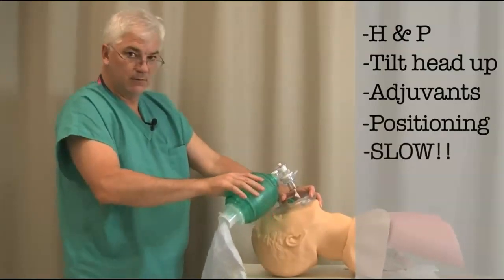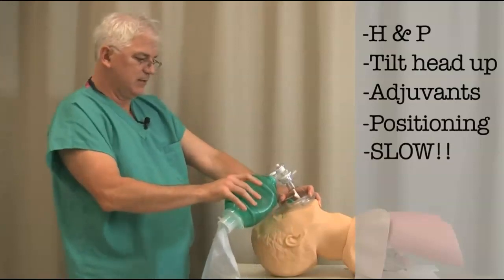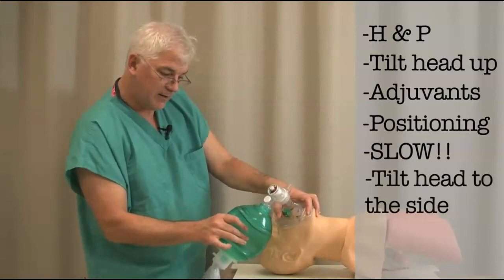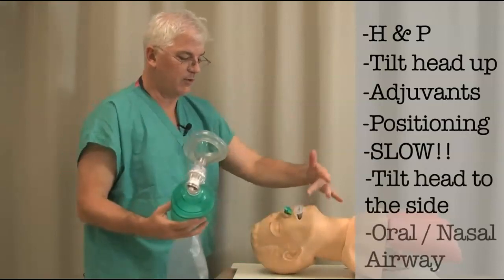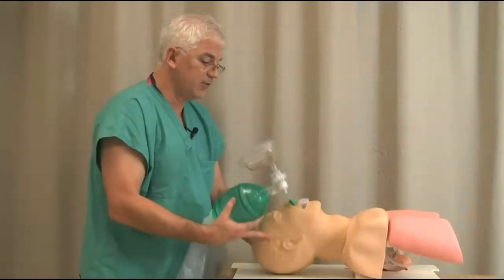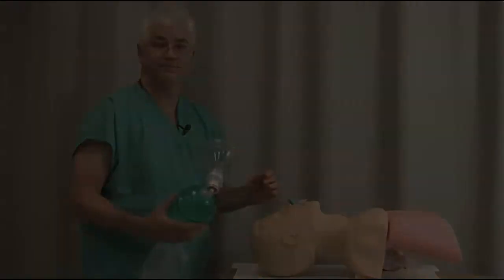Squeeze slowly. Don't do that. Squeeze slowly. Tilt their head to the side if you're not getting air in. And then put an oral and or a nasal airway in if you can't get any air in. So that's a little review on mask ventilation.